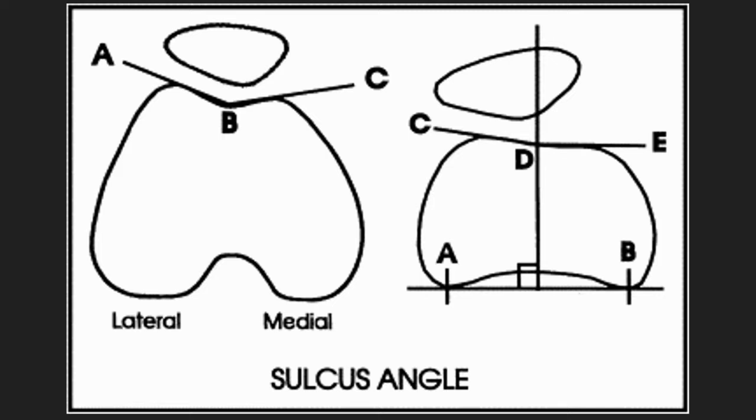And then the lateral patellofemoral joint lines did have an angle that opened laterally, so we found that that was within normal limits. And any findings for trochlear dysplasia are suggested at most and not definitive at best. But the most definitive finding was that of patella alta. So based on that, the qualified medical evaluator provided a permanent impairment rating for this particular examinee.